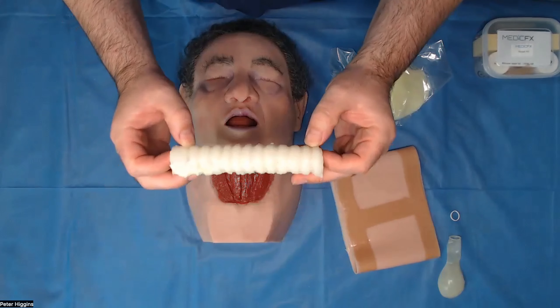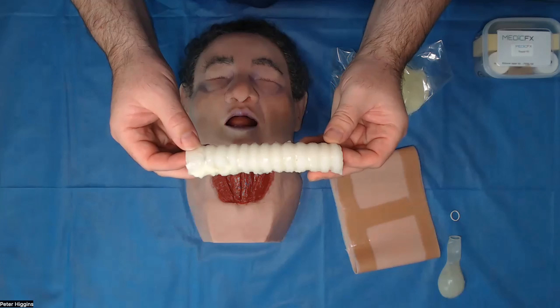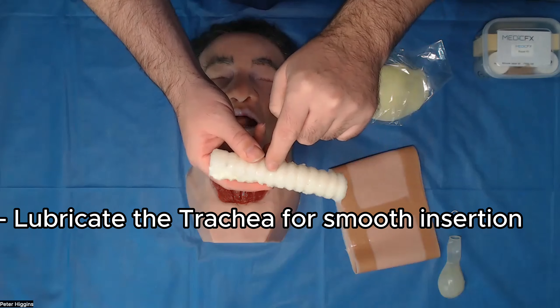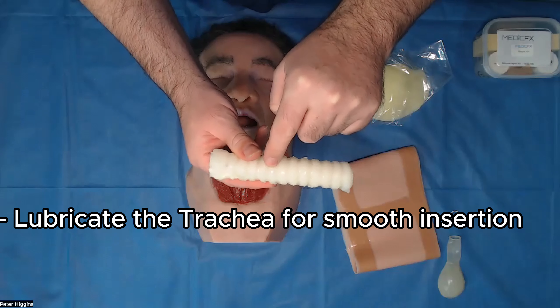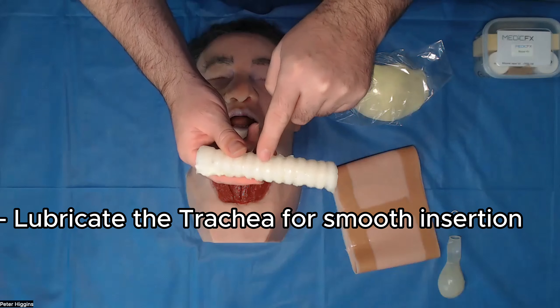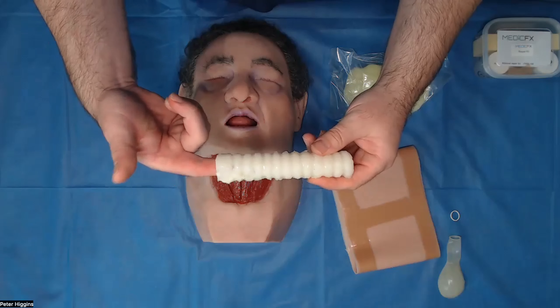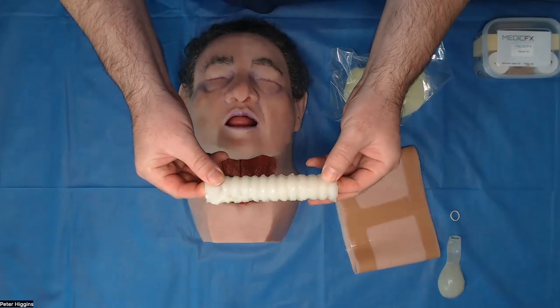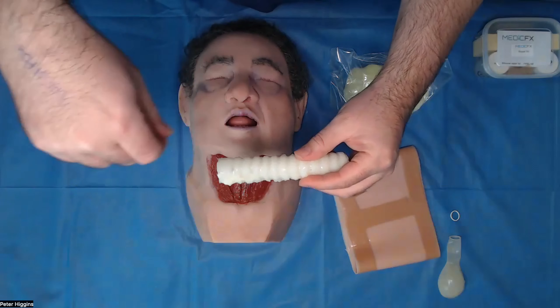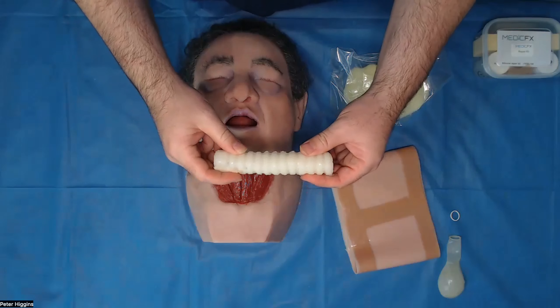This is the trachea component. The trachea component goes into one of the large holes at the bottom here, which I will show you shortly. Lubricate the insides before you insert it into the model. When the participants make their incision in the trachea and then try and pass the bougie and the tube into the trachea, it should slide in reasonably easy without any lubrication because of the type of silicone it's made out of. It can feel like the tube's getting stuck and quite difficult to advance without that extra lubrication on.